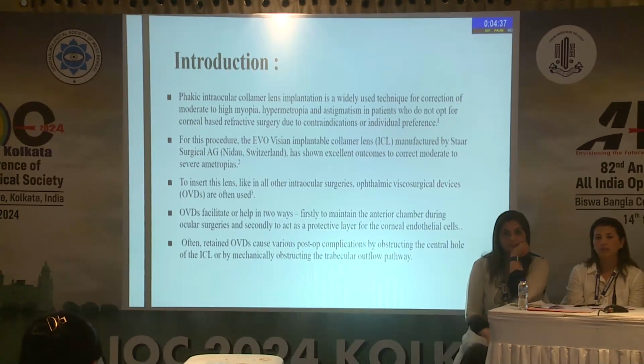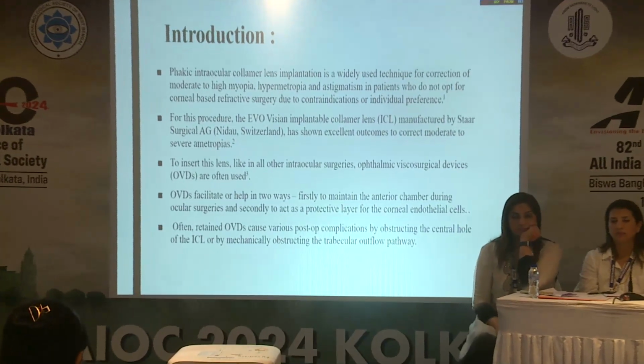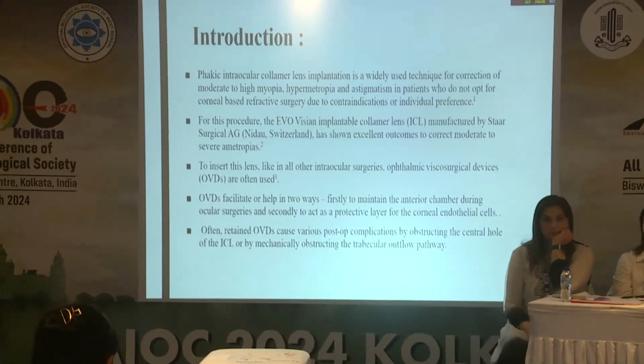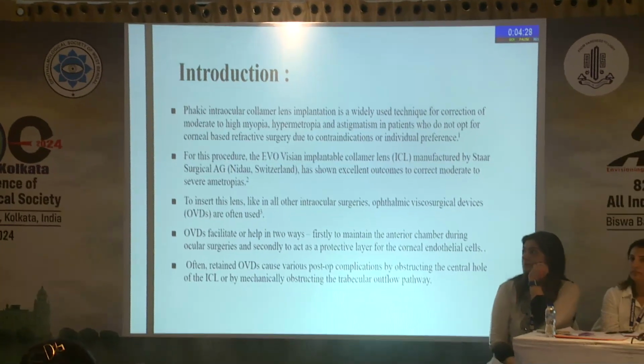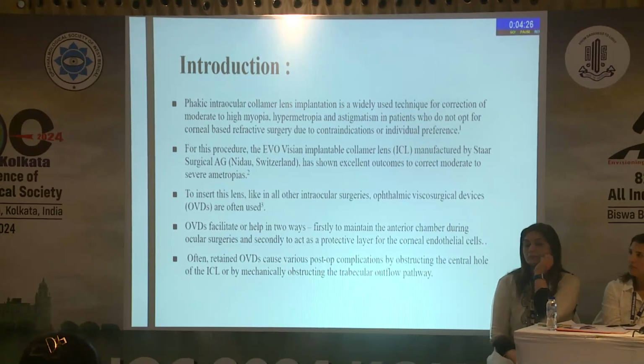So to insert the lens, like any other intraocular surgeries, we use ophthalmic viscosurgical devices. OVDs are useful in two ways. Firstly, it maintains the anterior chamber. Secondly, it also protects the corneal endothelial cells.